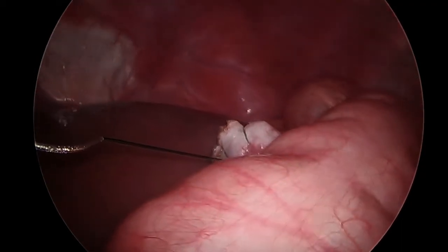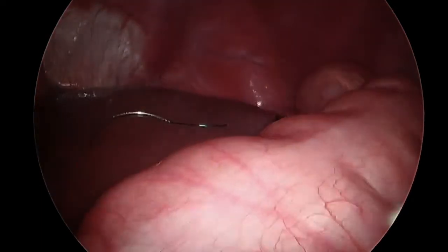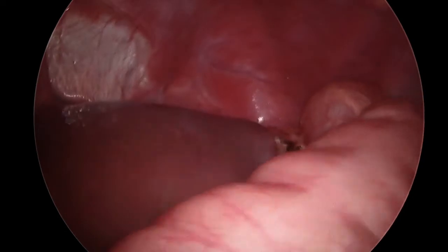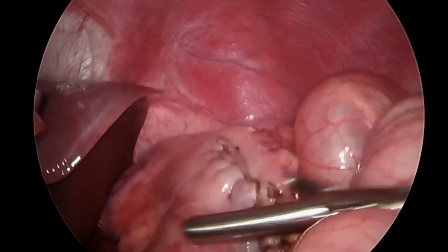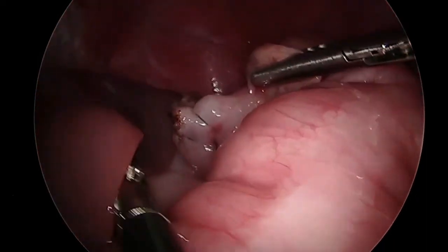To finish the suture line, two bites were taken in reverse direction. The suture line was examined and covered with an omental patch.